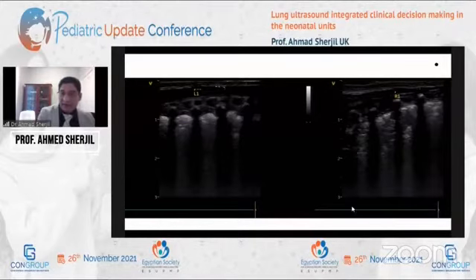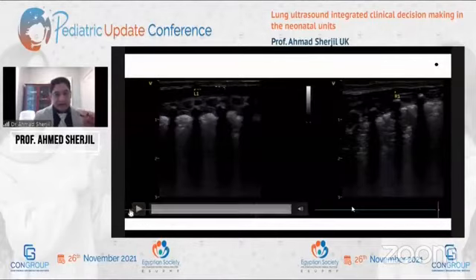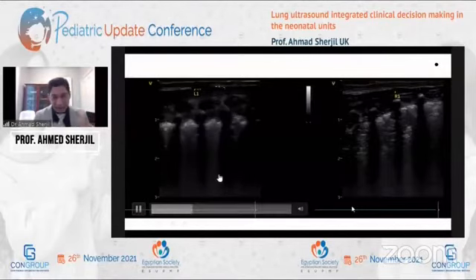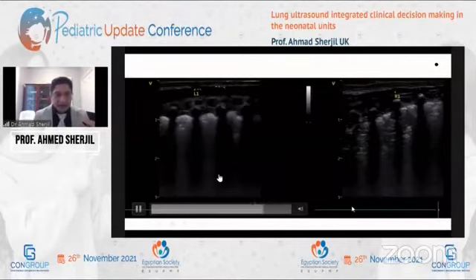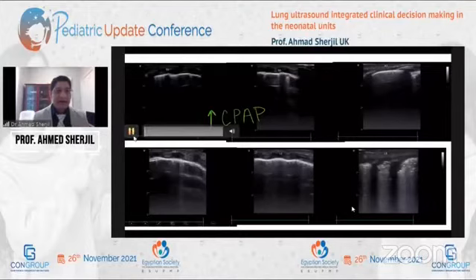just yet. I thought, let's go up on the CPAP pressure first, which was 6 centimeters, and I pushed it to 8, which was completely based on the scan. And having looked at these bad lung videos, it was hard to believe that after increasing CPAP, a little while later, I scanned the baby again and see how nice the pleura is looking.